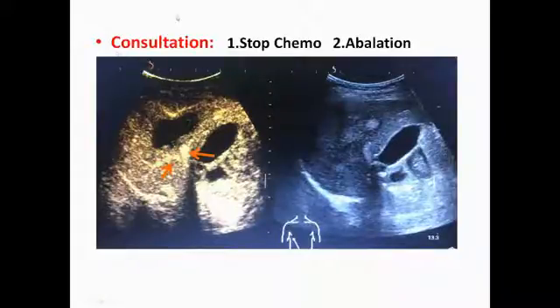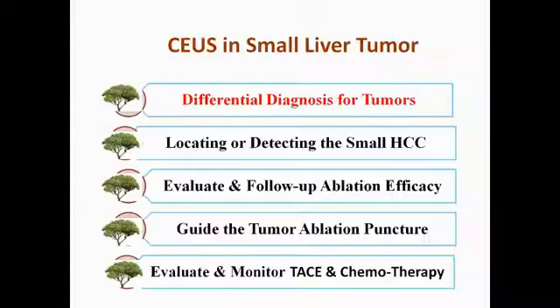The second consultation then happened. The conclusion was to stop chemotherapy and perform ablation immediately. So we can see contrast ultrasound is very important in clinical practice. So today, I'd like to say something about CEUS in small liver tumors.